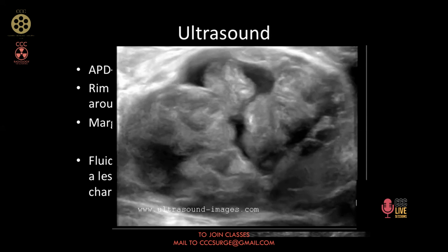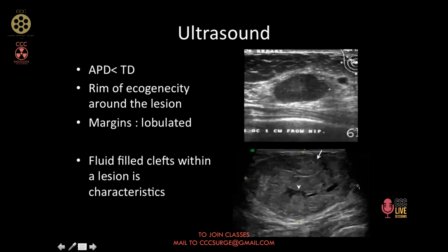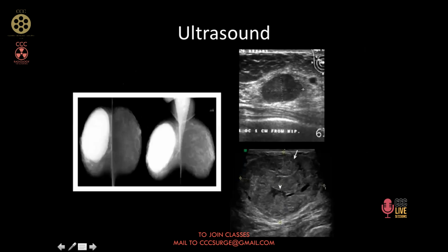Sir, can you please show me the perilesional halo? Look at this. This is the perilesional halo. This whitish area is the perilesional halo. Look at this. This whitish area is the perilesional halo. Okay. Now go back.